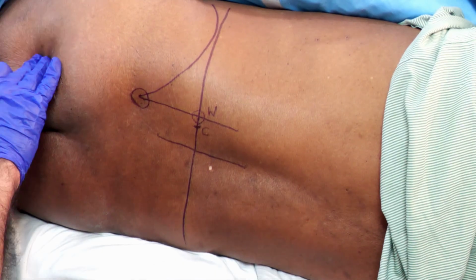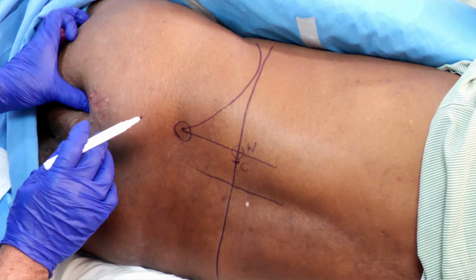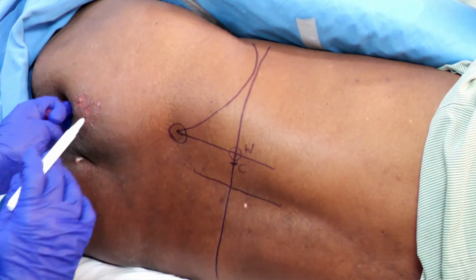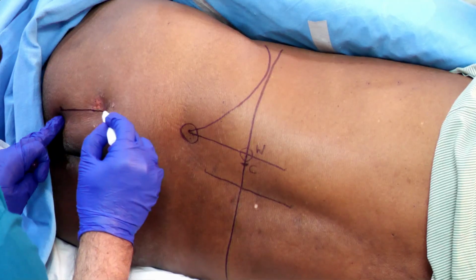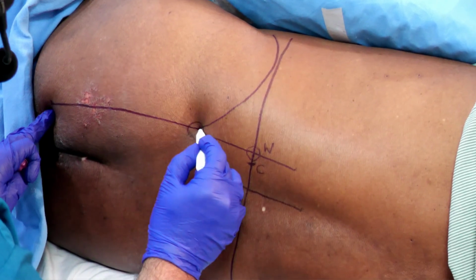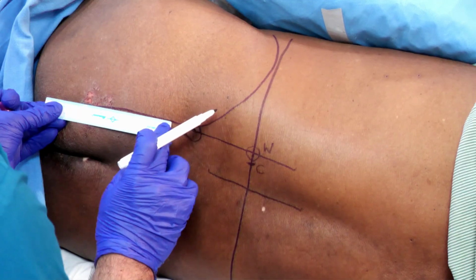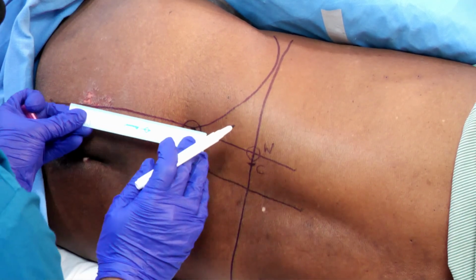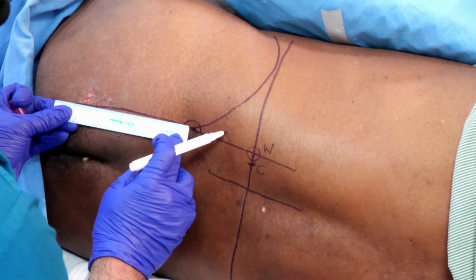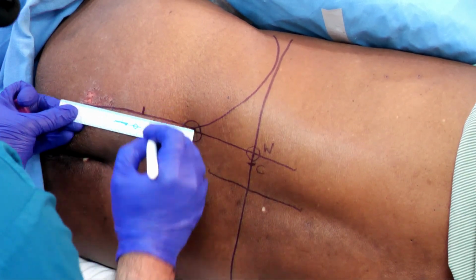Now the sacral plexus is between the PSIS and the ischial tuberosity. You have to palpate the ischial tuberosity and draw a line from the ischial tuberosity to the posterior superior iliac spine. You divide this into 3, or it can be 6 centimeters from the PSIS. If it is 6 centimeters from the PSIS, somewhere here would be the needle insertion along this line.